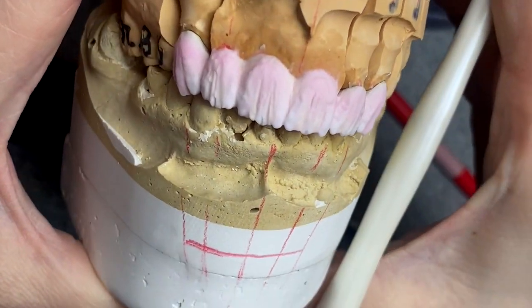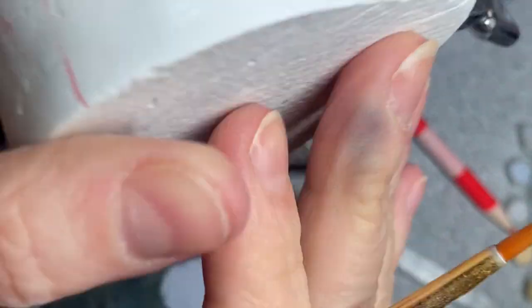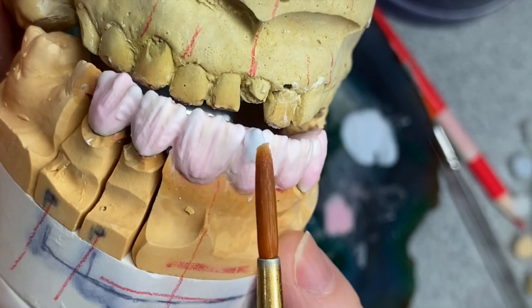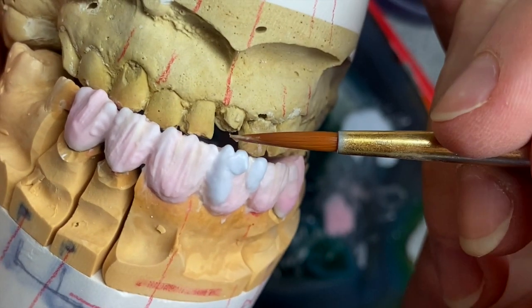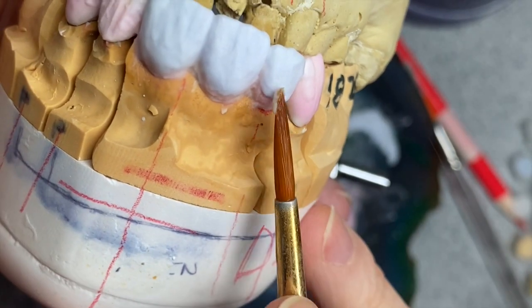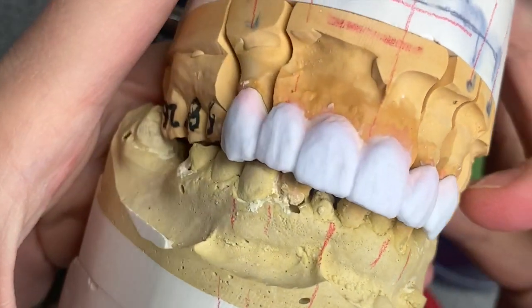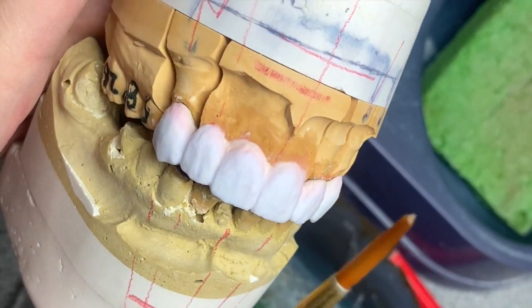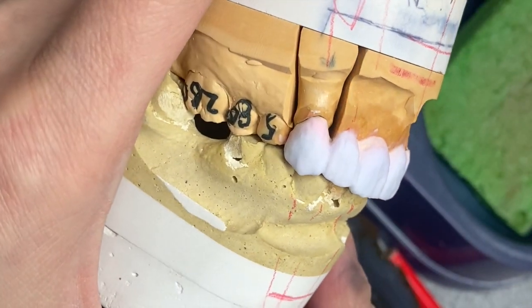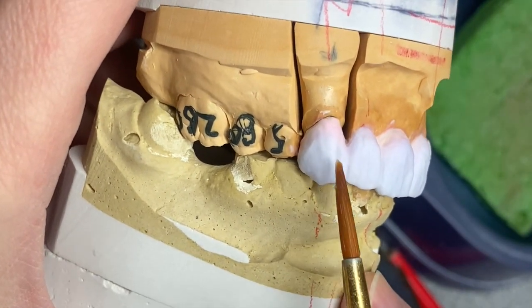That's what it looks like right now. Let's do the final shape by applying enamel. Now I'm done building it — I'm checking if my midline is still in the middle, and it is. My directions are looking correct, and it's time to bake it. I'll see you after bake.